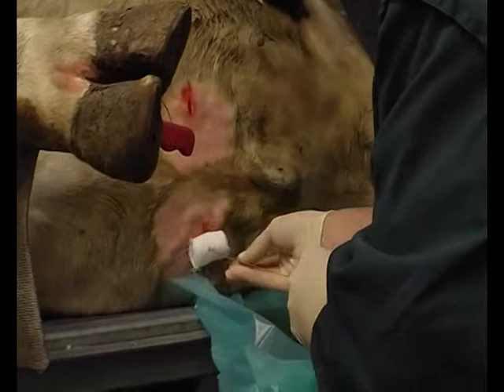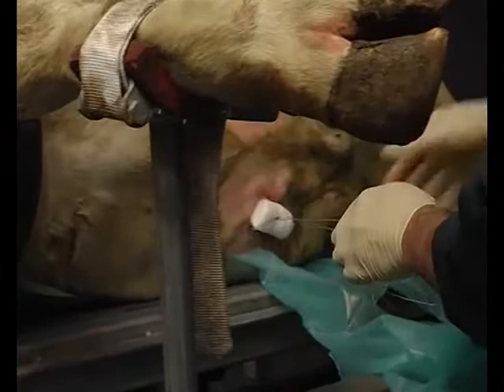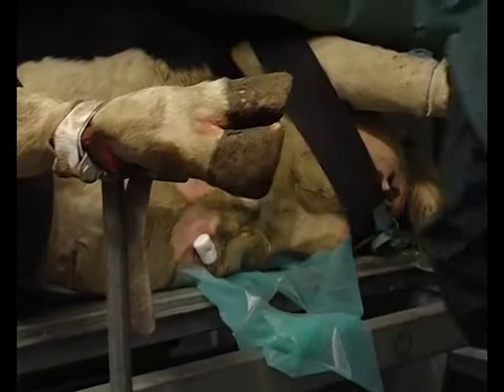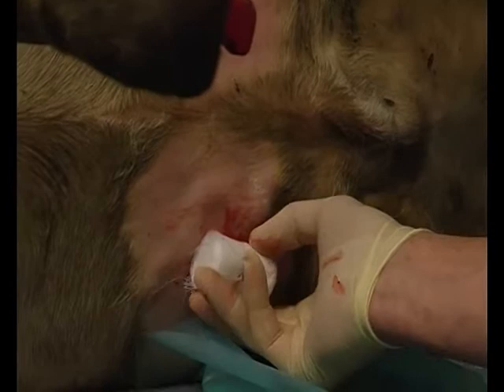Now I can knot it. I let it a little bit play, perhaps 1 centimeter for possible wound swelling. Yeah, but only 1 centimeter. And then we bring back the cow on her legs and we improve the tension on the wound gauze. Yeah, okay. So wound gauze we remove after 3 weeks, not earlier. Yeah? Okay. Good.